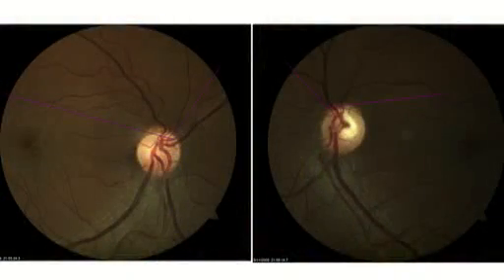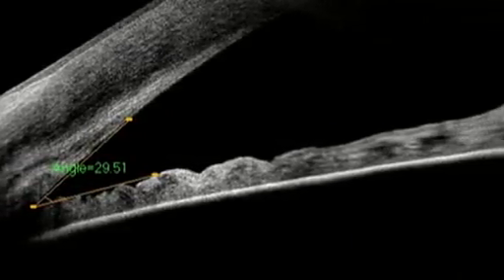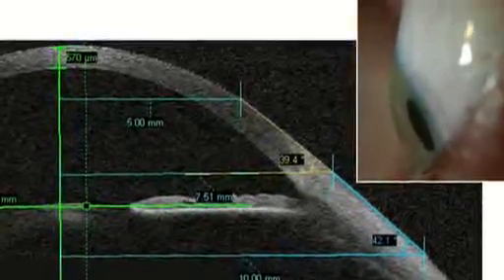The glaucoma patient, lots of considerations are given on a constant basis as to the wellness of the optic nerve and some characteristics of it, of what's called cupping, and we can now look with micron specificity at the cup of the optic nerve and find small changes that are occurring and intercede sooner than we would have otherwise without the OCT. The OCT can be used to evaluate the front structures of the eye, the cornea, the anterior chamber, for the glaucoma patient, for looking for the drainage of fluids there. And it's a great tool to look at thickening and thinning problems there as well.